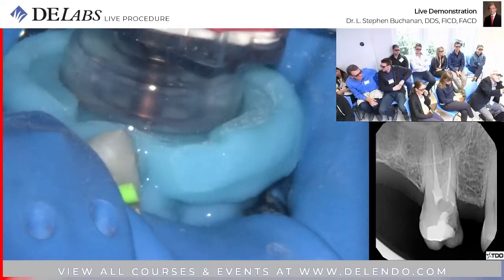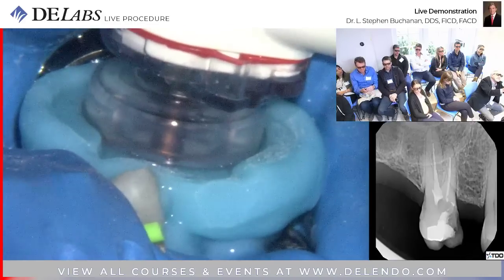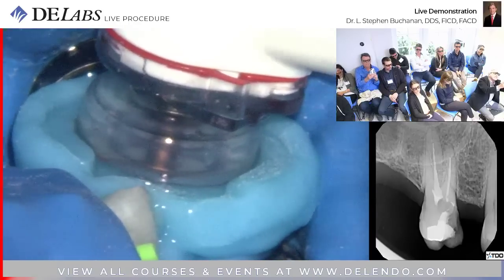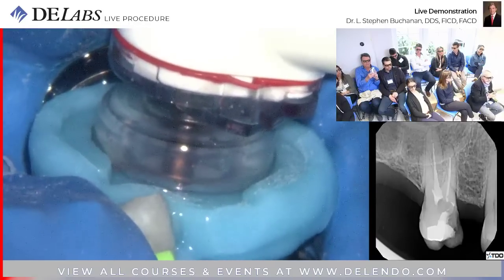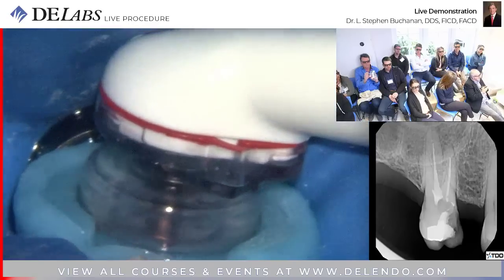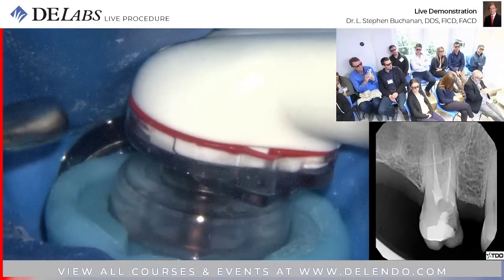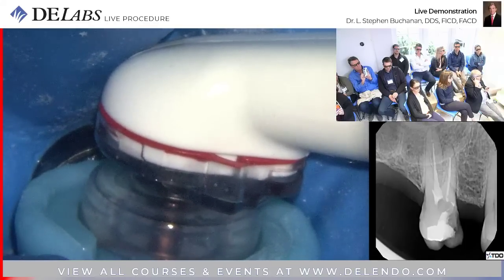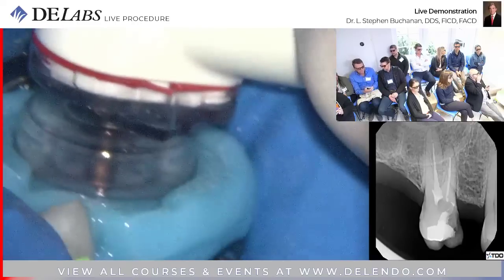Oh, the other thing I was going to mention is they degas the fluids. So that oxygen liberation effect down at the end of the root canal is greatly dampened by degassing before they actually shoot the solutions. 1 minute. We got a minute left.